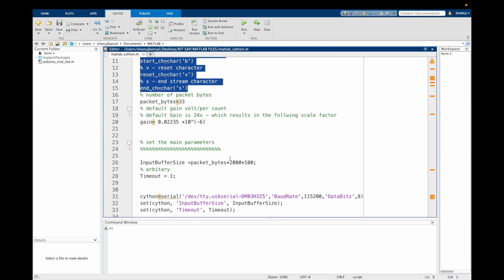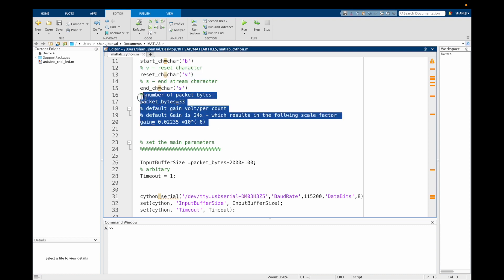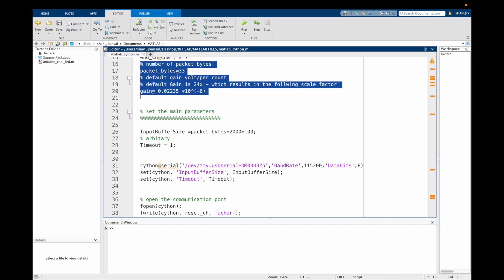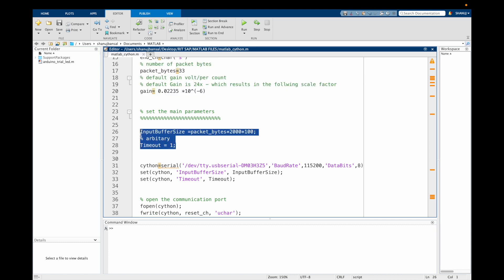We then define the number of packet bytes and the scale factor based on a 24x default gain. Now coming to set the main parameters of the code, such as the input buffer size and the timeout. These are set as arbitrary values which seem to work pretty well.